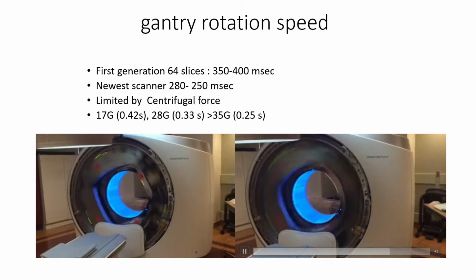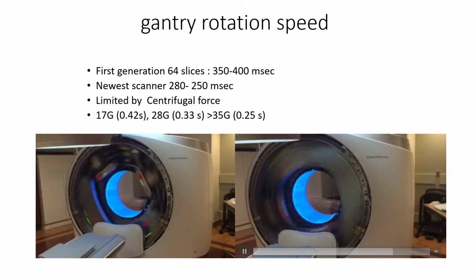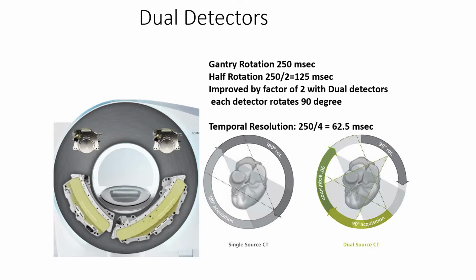Okay, so this is the gantry speed. And that's the reason why we cover it, right? Because with that, I don't think anybody will want to go in there.